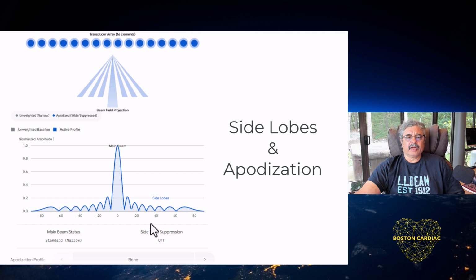Now, as we had talked about, the process of apodization consists of creating a stronger beam that is stimulating the elements in the center of the beam more than the others, which leads to significantly underpowered sides of the beam, albeit at the cost of a slightly broader beam.